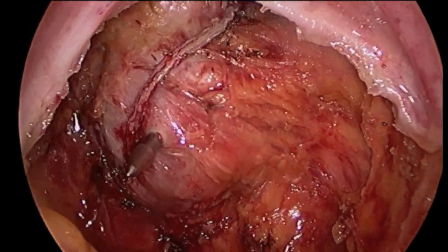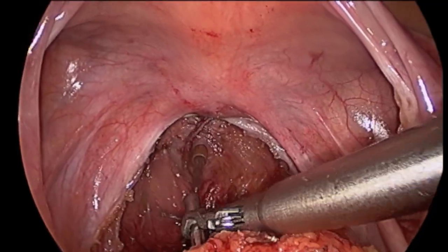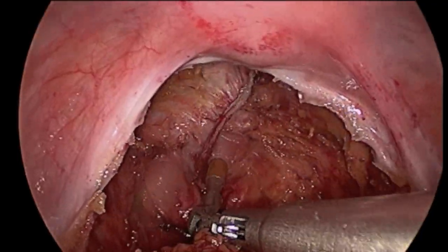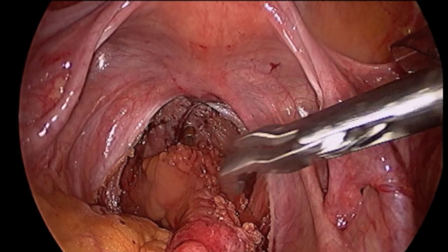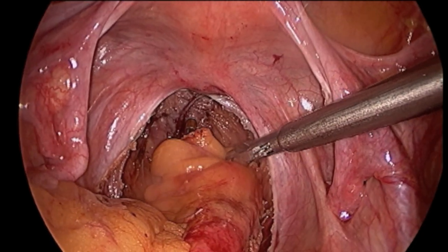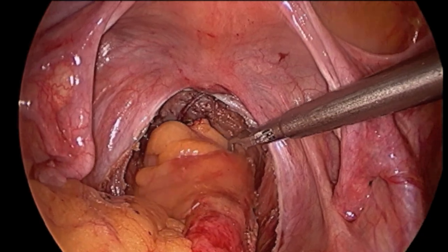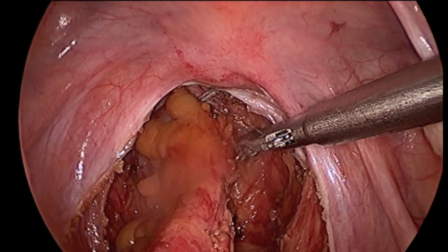The main part of the end-to-end anastomotic stapler is then inserted into the rectum, and the center spike shaft is slowly advanced to the rectal stump adjacent to the prior staple line. The stapling device is connected, carefully closed, and then fired, joining the two ends of bowel by forming two concentric circles of titanium staples and cutting a hole inside the ring of staples.